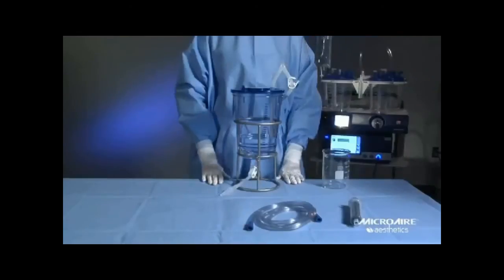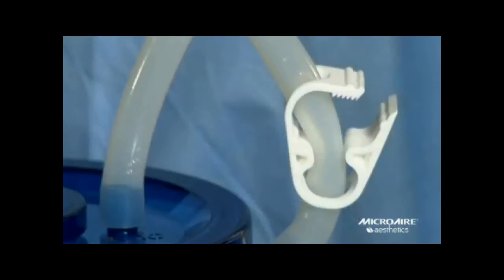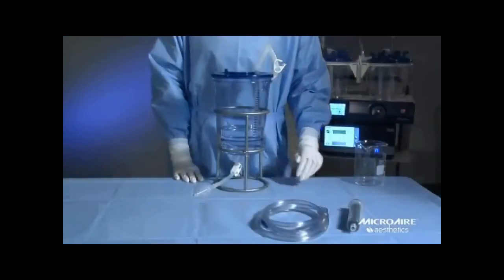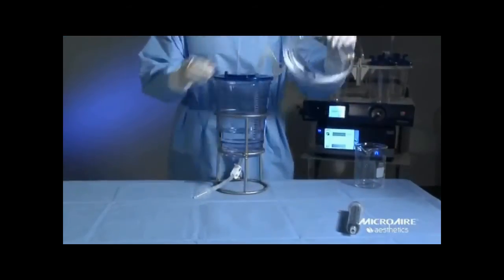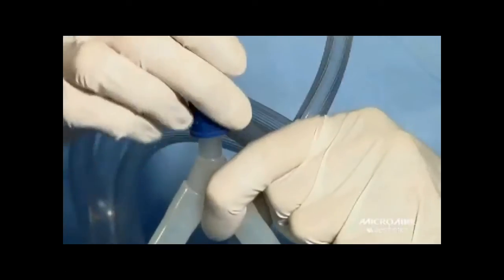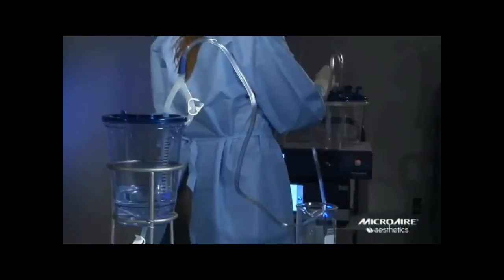It is important that the white pinch clamp remain open during the harvesting process. Only close it to drain the fluid. Attach the sterile transition tubing to the top connector on the manifold. Connect the opposite end to the waste canister.